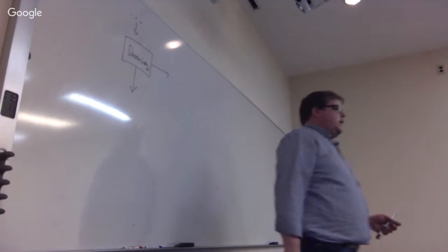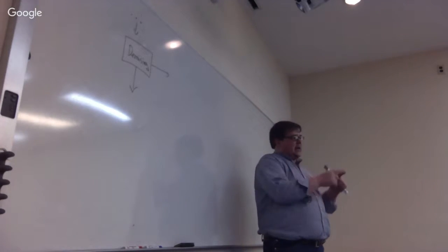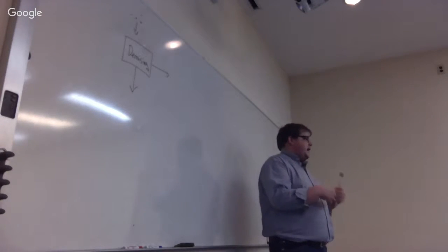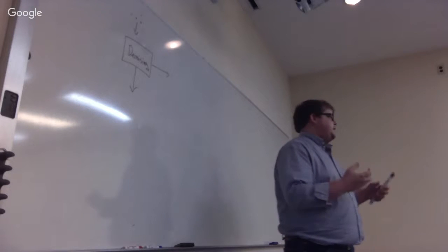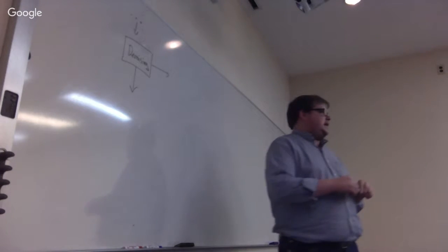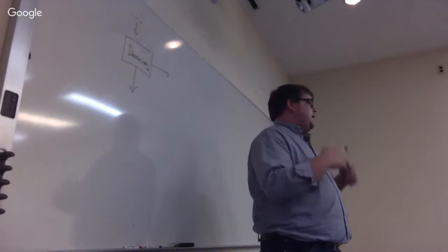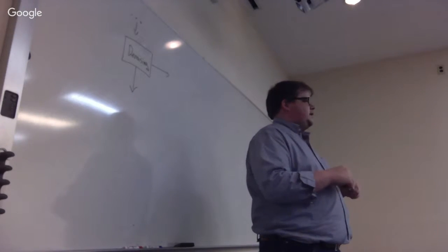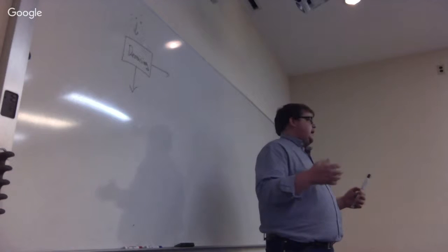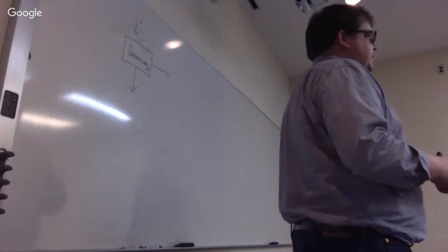So now we're going to do the individual level analysis, right? And so the individual level analysis takes that time series of ROIs and constructs a single map from that has some contrast that we're interested in for some aspect of brain function, right? So this is analogous to individual level analysis for task fMRI, where you would do your GLM, for example. Here, the analysis might be ReHo, might be VMHC, it might be a couple of different things. And we'll go through those a little bit, but first I wanted to talk about how exactly we do that, right? And so there's two kind of subdivisions of the individual level analyses that we do, right?